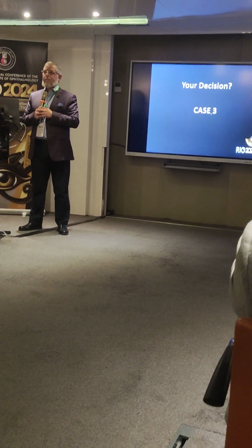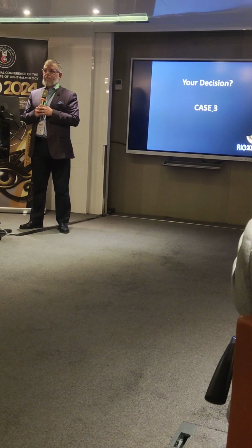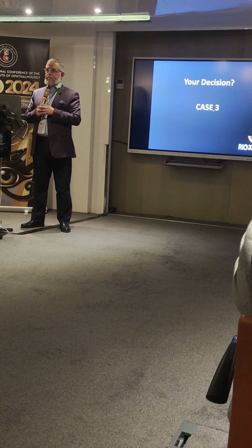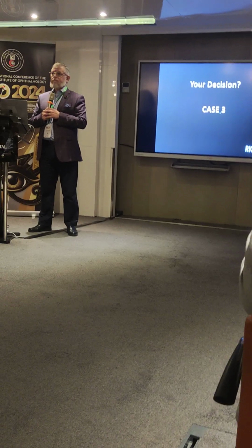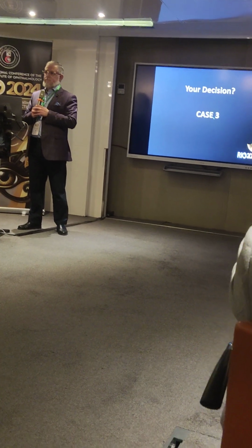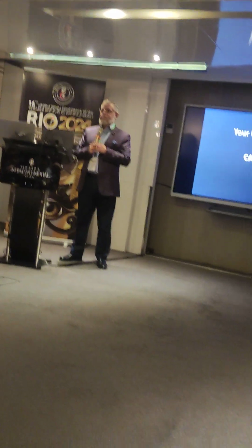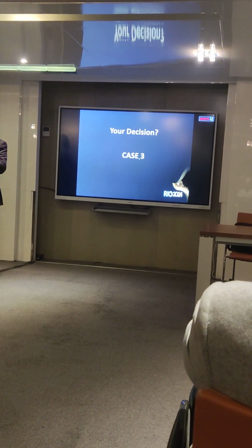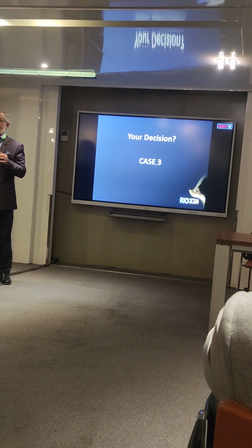The Lens Comfort is a lens that has a segment for near vision, with a very smooth transition zone. It's EDOF as well, and it is a very, very tolerant lens, no problem absolutely in post-operative, post-LASIK patients. I had a very big experience with this lens specifically and with the Smart, and in both cases the results are really good. Fantastic, thank you for sharing your experience. Easier and safe lens, totally the Eyhance.